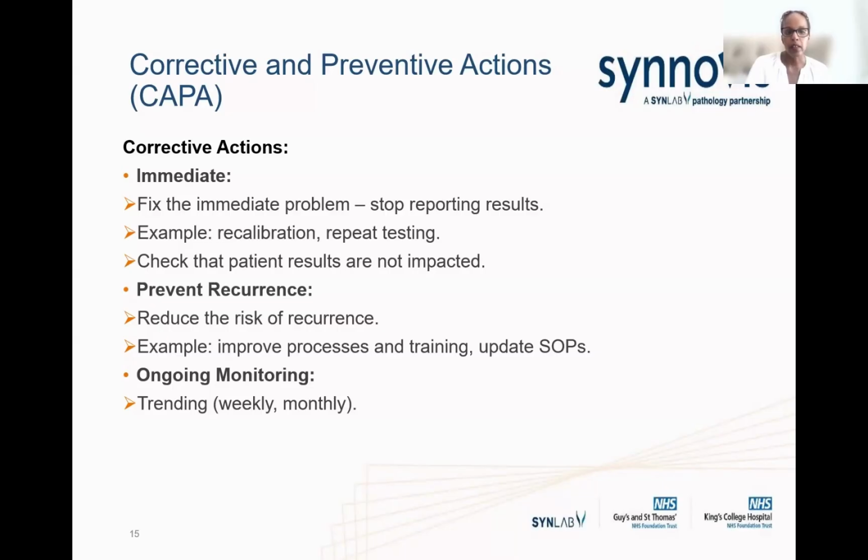And then you consider other things such as the reagents, recalibration, and repeating again, and see whether that resolves it. It all depends on what you identify in your investigation and what you focus on. So you fix what you identified, basically. If you identified something that could be the cause, and there could be other factors that could impact it, you make sure you focus on what you think has caused it, and then you focus on the contributing factors after that if it's not resolved.